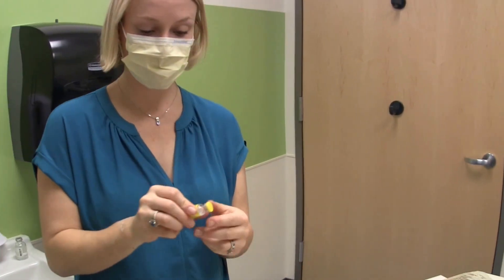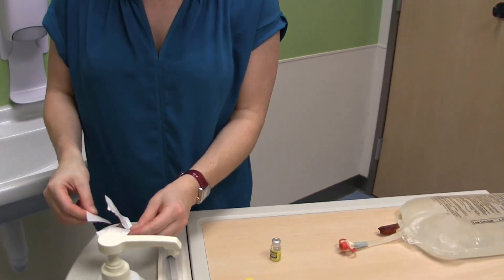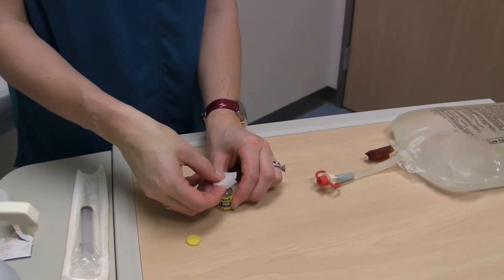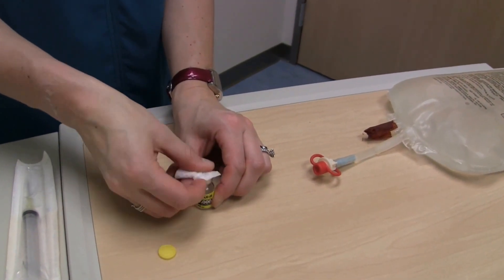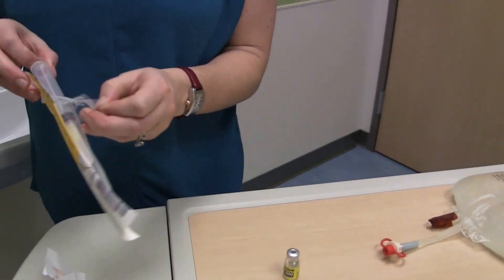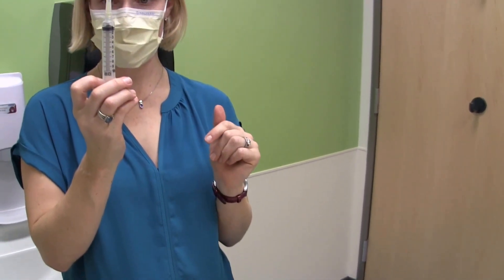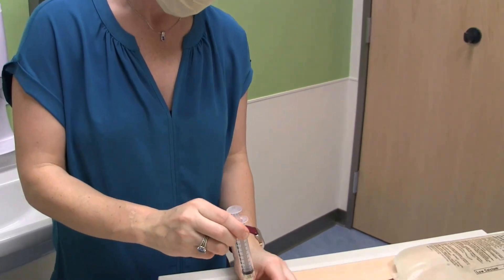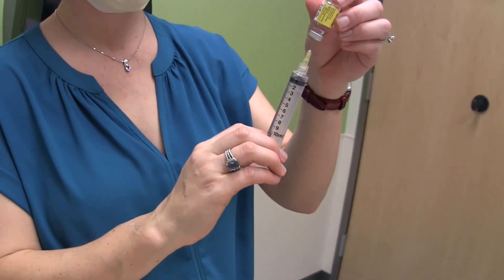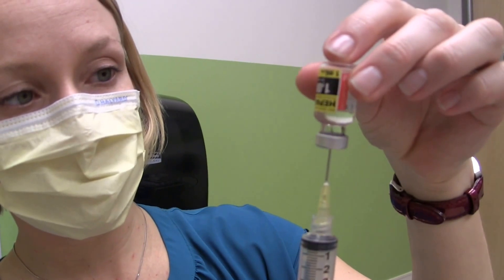During this five minute time, I'm going to remove the lid from my heparin, scrub the top with an alcohol swab for 10 seconds, open up my 10 milliliter syringe with a needle, and pull back one milliliter of air and inject it into the vial of heparin in order to assist with pulling the fluid out. Making sure the needle is staying in the fluid so I'm pulling out fluid and not air.